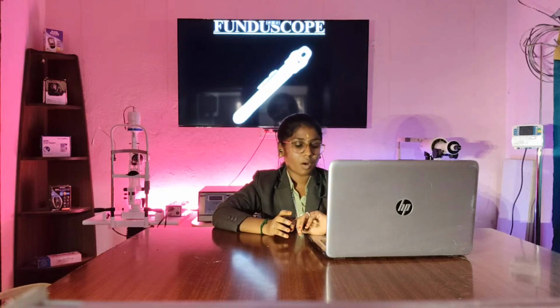Okay. So as we see, the slit lamp is used to diagnose the corneal layer and iris layer, which are externally present in the eye. But the fundus is very deeply present inside your eyes. It will be more depth also, like it will go to a centimeter depth. At that time, the normal slit lamp will not recognize the particular problems present there.